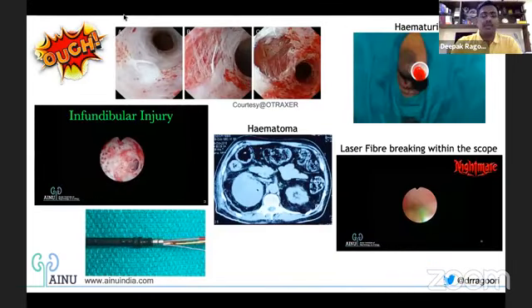I'll not go deep into the complications because that's not part of my talk. But you have to respect the anatomical limitations in doing flexible ureteroscopy or choosing your cases, or you'll end up seeing ureteric injuries like this, or hematurias, or maybe even a perinephric hematoma, which is a dreadful thing for you. The infundibular injury, which is a tiny clip I'm showing, is the one where the infundibular width is narrow, yet you force your scope inside it.